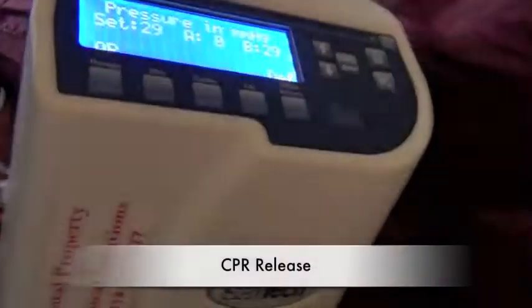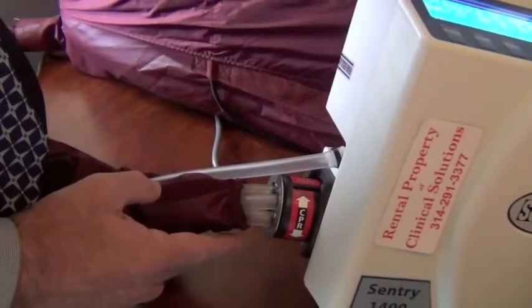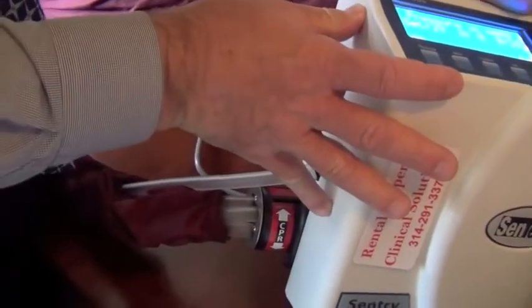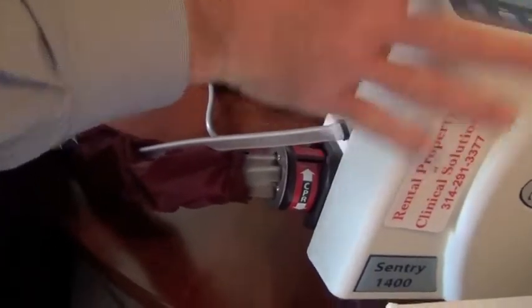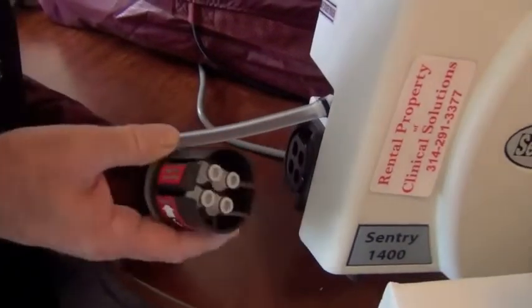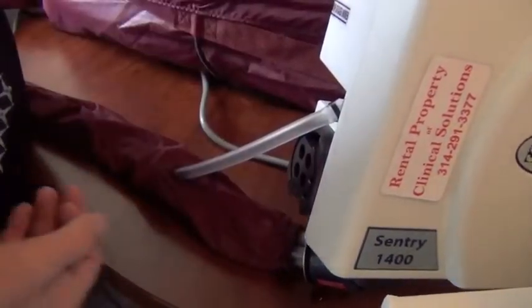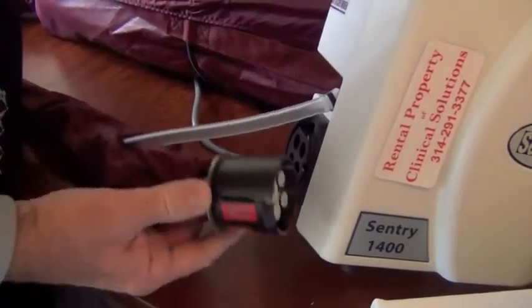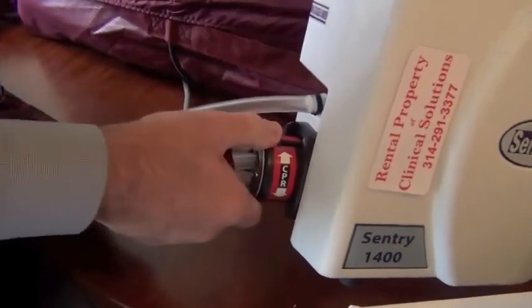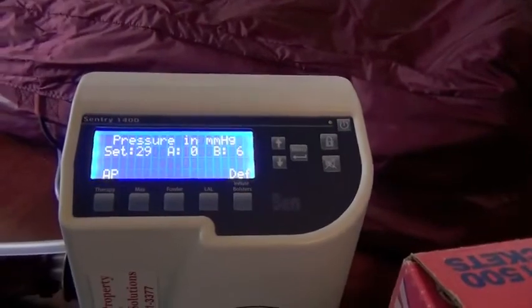On the side here, we have our CPR dump. If you have an emergency situation where you need to perform CPR, we would recommend that you turn the power off on the device up here where I showed you before, and then it's simply a matter of squeezing this and pulling it out, releasing it, and now the patient's weight will force the air out of the system pretty quickly. When things are taken care of and resolved, you push this back in, you can hear it and feel it click into place.